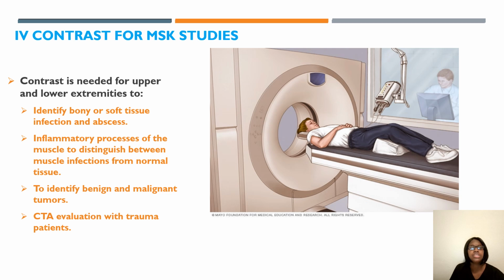If contrast is ordered for your MSK studies, it's mainly going to be for some type of infection, abscess, inflammation, to see if a tumor is benign or malignant. So there are different reasons for this. Just make sure that your patient is not allergic to iodine.